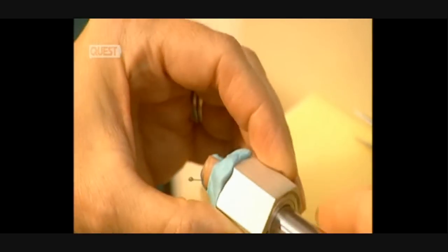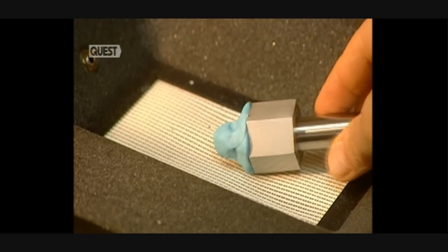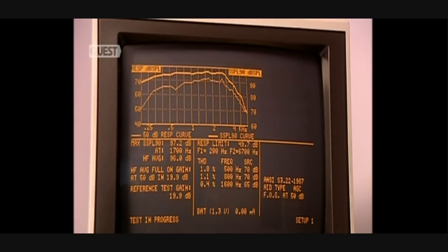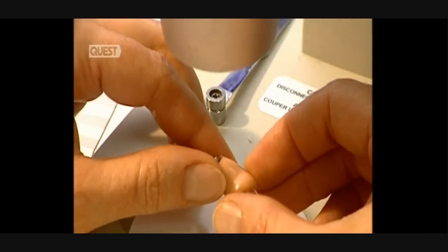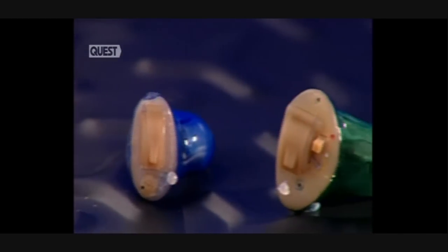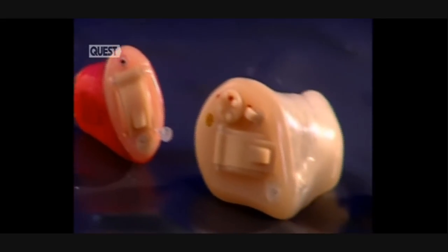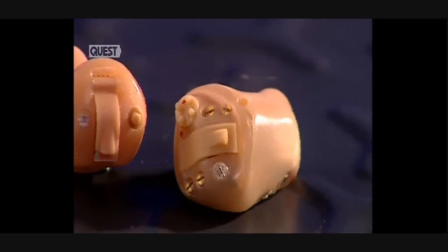The prosthesis is now completed. There remains one important step: verifying its electro-acoustic characteristics. It's with this analyser that they validate the hearing aid conforms to the original prescription. These minute devices are key to improving one's sense of hearing, and with digital technology perfectly suited to this field, hopefully even smaller units will be created.